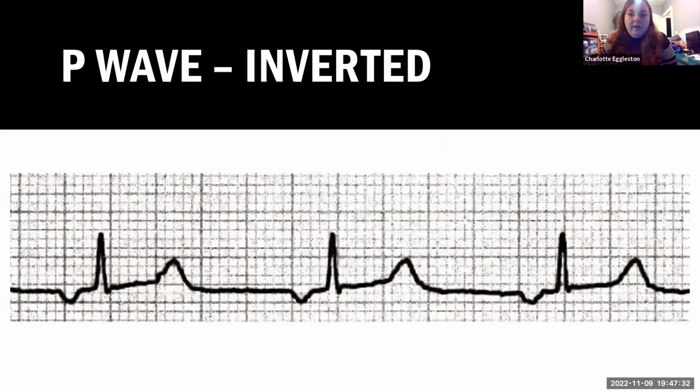Which I think I'll talk about again in a little bit, but effectively we'll talk about that more when we come to the PR intervals. It will mean that the spread isn't coming from the sinoatrial node. It could be coming backwards from the atrioventricular node. It might be you've got an ectopic focus somewhere else. Obviously, because then it means it's likely that it's not a pacemaker that's designed to do the P wave that's causing that wave. You can often then go into weird rhythms and things, and potentially even AF from there.